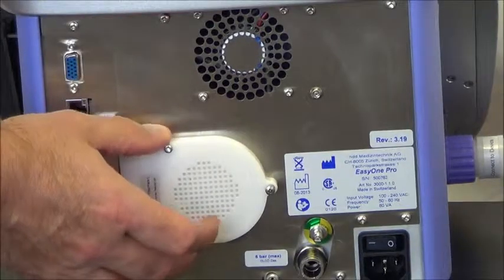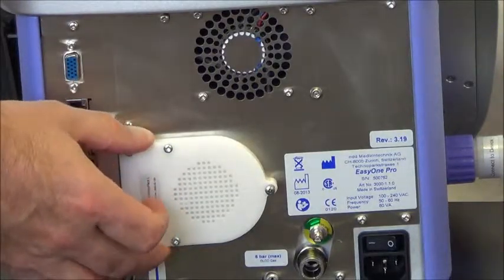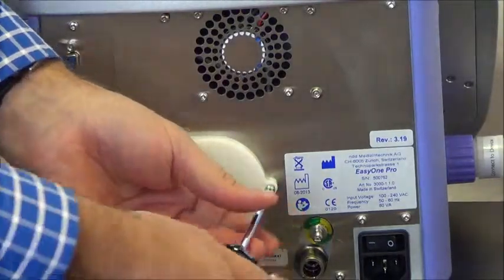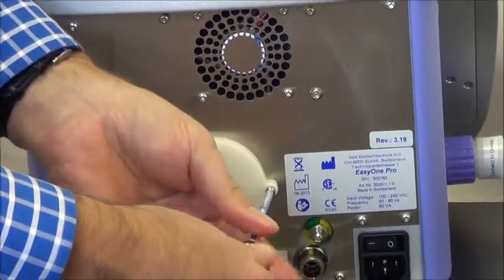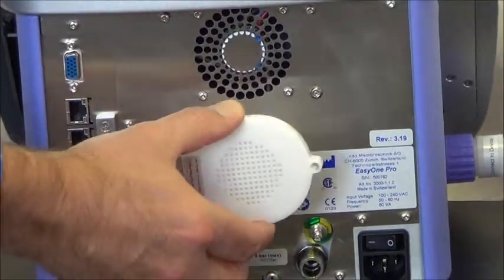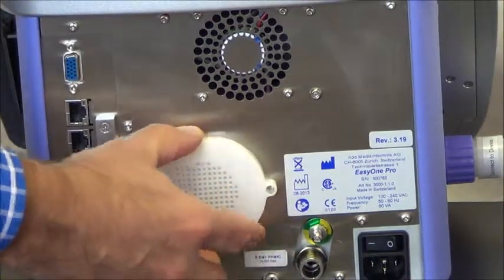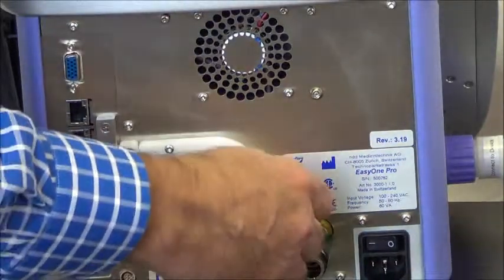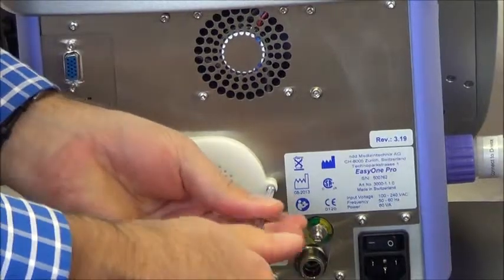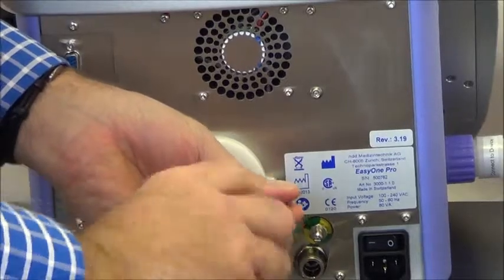The next part is the filter pack assembly, which is on the rear of the device. All that's required to remove and replace this is a Phillips head screwdriver. One screw is all that's required to remove this part. Unscrew the Phillips head, the filter pack pops right off, and then the new filter pack lines right up. Single screw to reinstall — don't need to over-tighten.